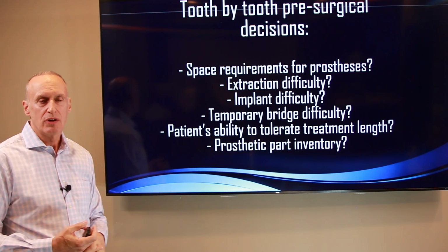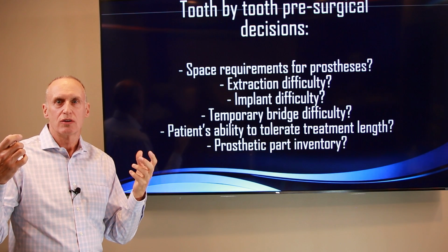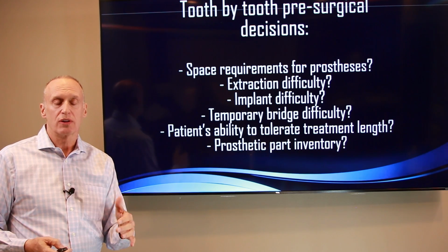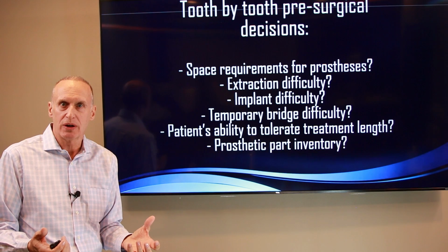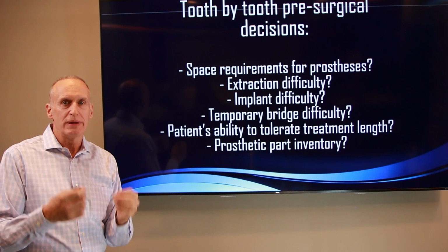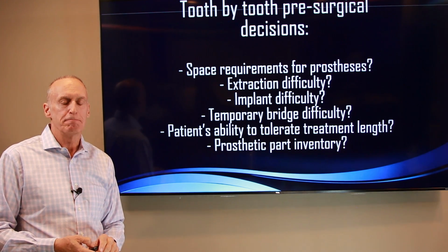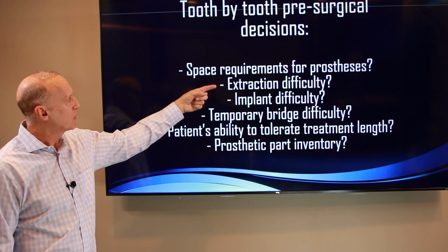How hard will the teeth be to get out? We've got patients, and I jokingly refer to them as Neanderthals because their teeth are like in concrete or granite. I have worked over an hour taking one tooth out. Not because I'm slow, but because if you force a big tooth out of the bone too aggressively, you break the bone. Well, I'm not taking a 0.5 millimeter of bone away from my patients, so every little bit of bone is precious to me because I want to use it to give them back, well, to maintain, right? So if I break the bone from taking out a tooth too aggressively, that hurts the overall final product. The teeth don't look as good. So that's a big question I always ask.